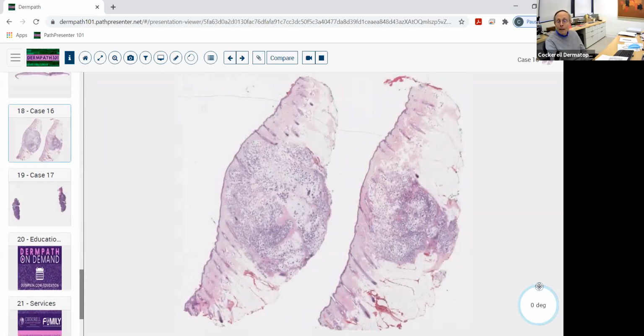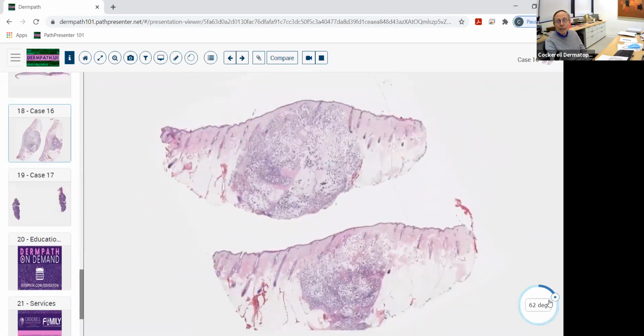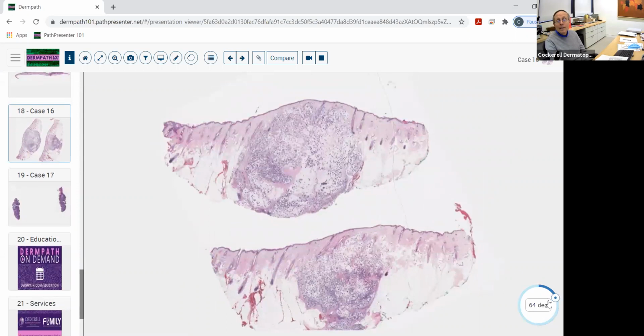Okay, let's take a look at this. So this is a beautiful biopsy, and chances are here they probably did not do this first. So, we don't expect to get excisional biopsies. Dermatologists love the shave biopsy. That's the biopsy technique of choice.